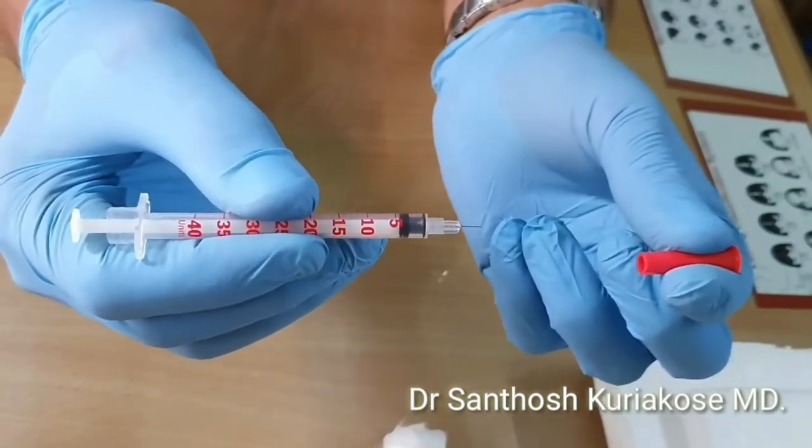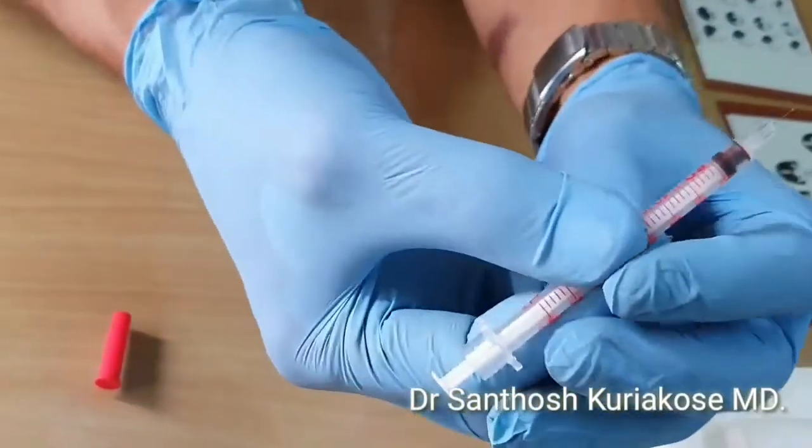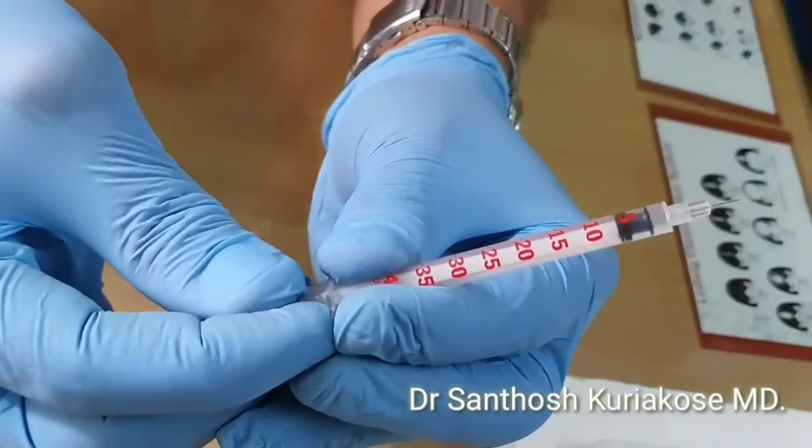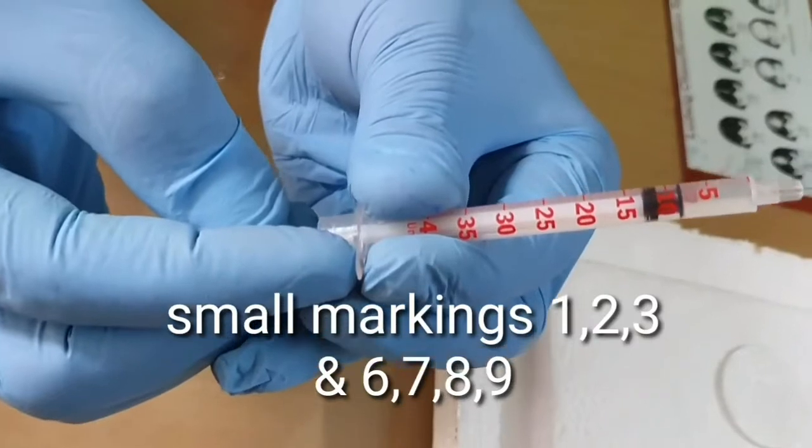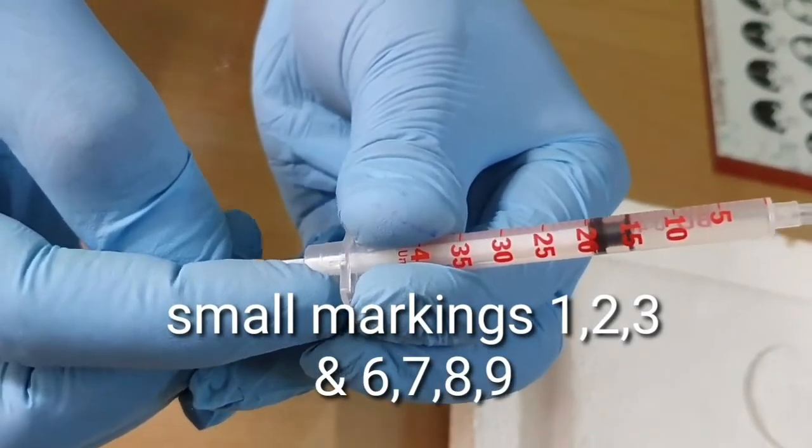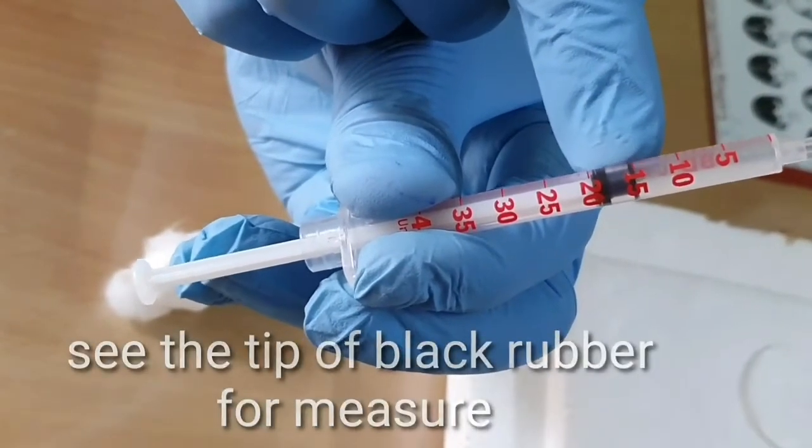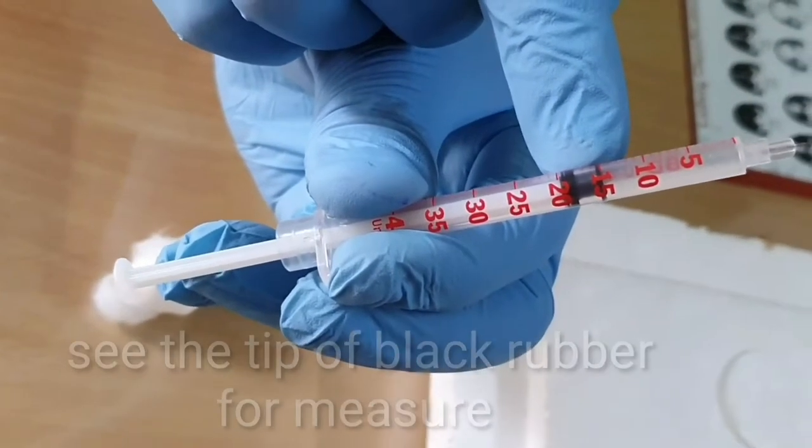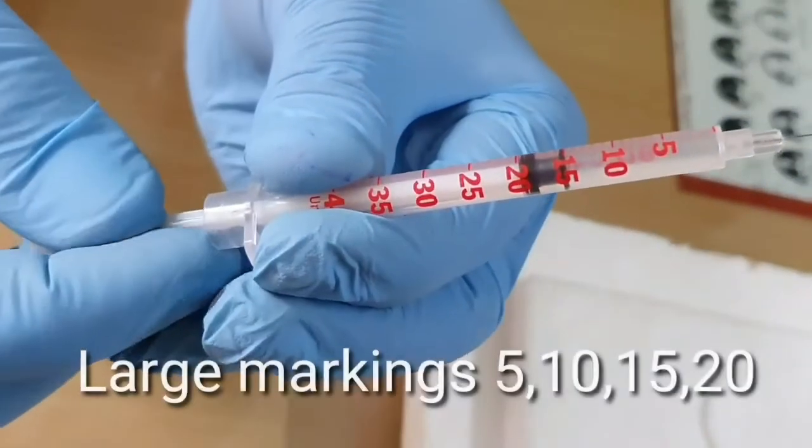Now if you see on the syringe, you can see markings. There are larger markings where we have 5, 10, 20 like that, and we have smaller markings in between. The markings are calculated or measured by the tip of the rubber black rubber plunger which is there inside.